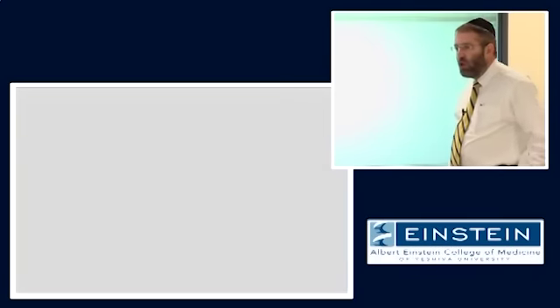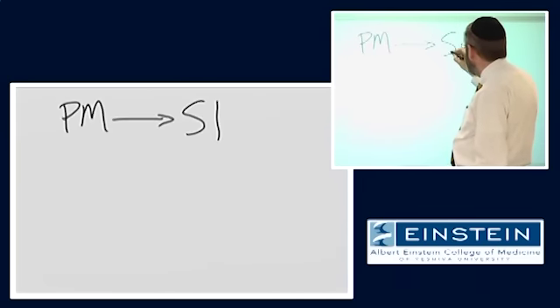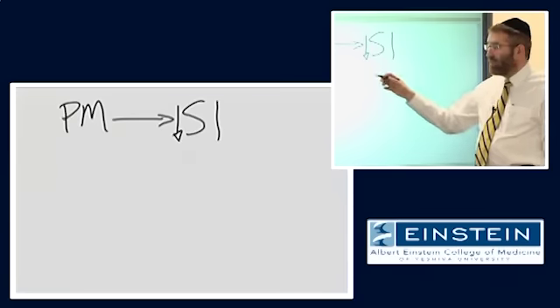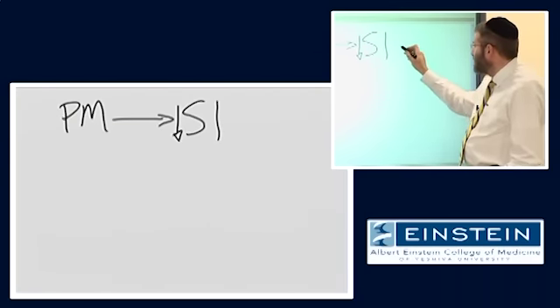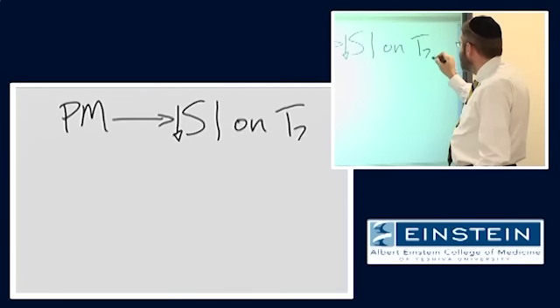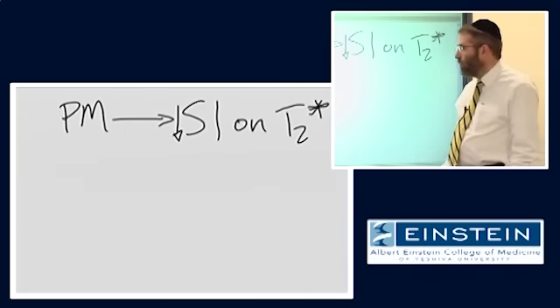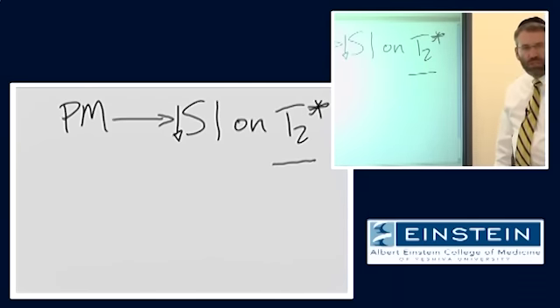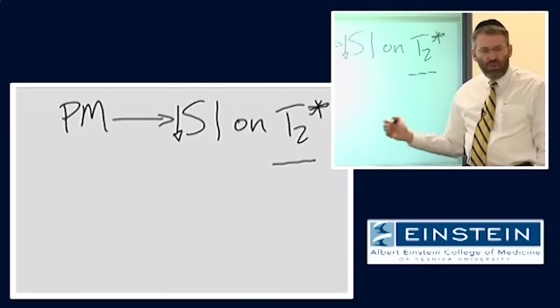At this point, we know that some paramagnetic substance will lead to a decrease in signal amplitude on an image that is sensitive to these magnetic susceptibility effects, right? Which is most commonly going to be a T2 star sensitive or weighted image. And we've already said that we can choose to use this type of T2 star weighted image to generate some diagnostic information. If you want to detect small areas of hemorrhage or calcification, that's the type of image that you want to choose.